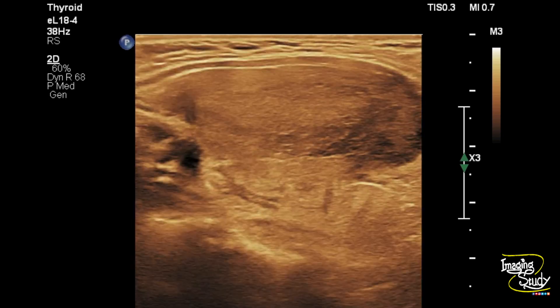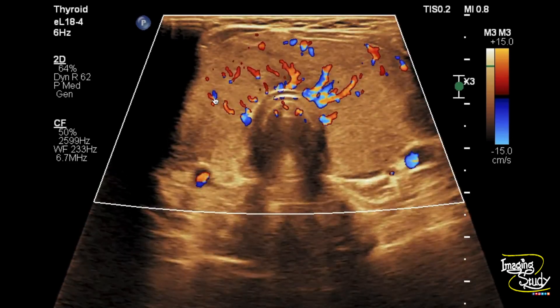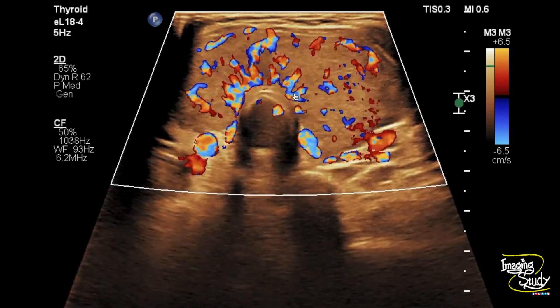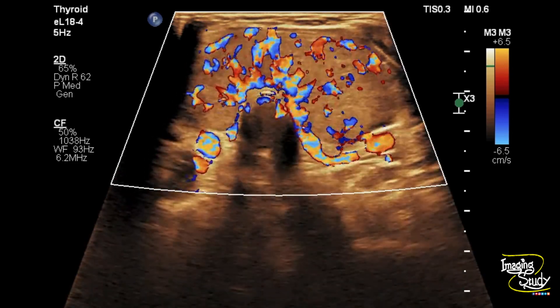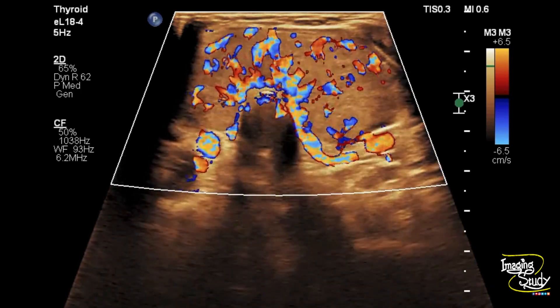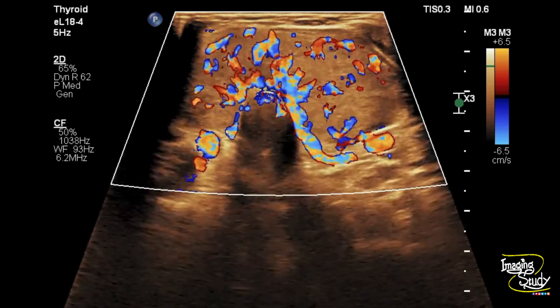Now let's put the color Doppler. Here's the color Doppler on the transverse section and you can see very prominent vessels within the thyroid gland. We have moved the transducer a little bit inferiorly and you can see the inferior thyroid arteries inserting into the thyroid gland and giving a very high flow. This type of flow pattern is commonly known as thyroid inferno, quite like fire on a hill. If you see a very rapid jet of blood flow coming from the thyroid gland, it is better not to go for FNAC at this time.